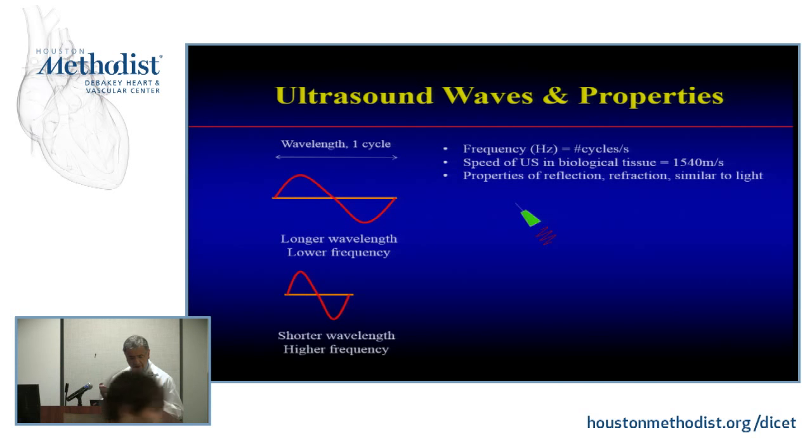So you have this ultrasound transducer, and the transducer, we're not going to go into it, but I think it's important for you. It has a lot of piezoelectric crystals, meaning if you excite them, either mechanically or electronically nowadays, they emit a little burst of waves, and that's what you want to do. You want to emit a certain burst of waves that goes and reflects off a surface, and that surface for us would obviously be part of the heart, could be a muscle, could be a valve, could be whatever it is.